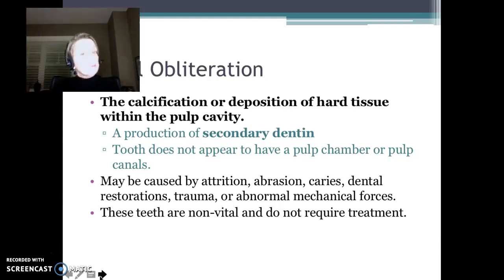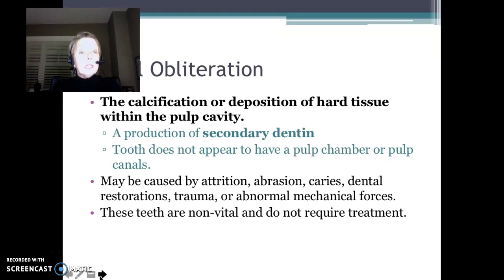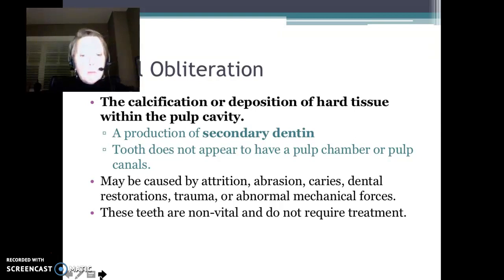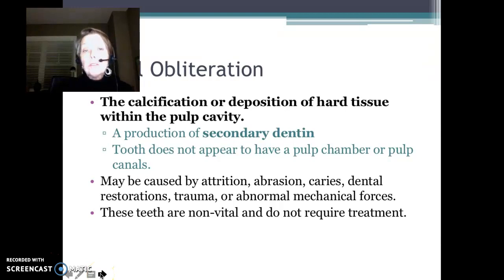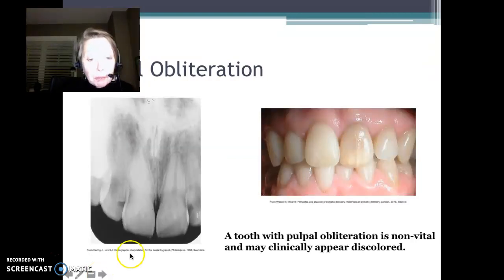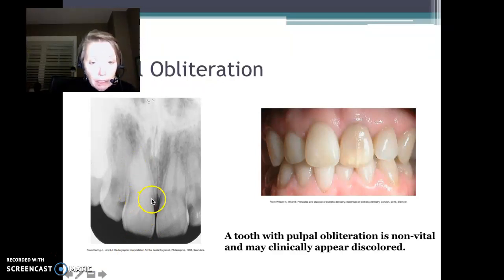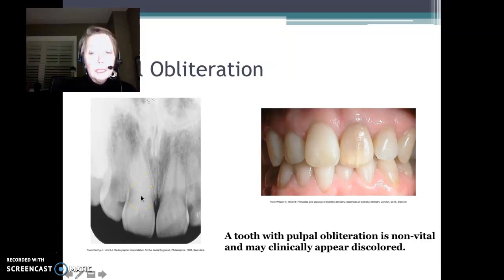Pulpal obliteration is just what it sounds like — the pulp itself is completely obliterated due to calcification or deposition of secondary dentin into the pulp cavity. When you look at it on an image, it looks like there's just not even a pulp chamber at all. These teeth are non-vital, dead. They don't require any kind of treatment. Take a look at this image on the left — tooth 8 and tooth 9. Tooth 8 appears to have no pulp chamber whatsoever; it is completely obliterated.